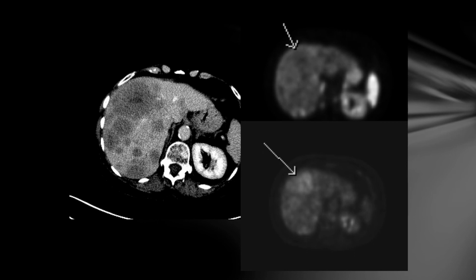So this shows that a cell that takes up a lot of the sugar molecule is either growing quickly, or it's not really expressing those cell surface markers of neuroendocrine tumours anymore. It's a little bit less organised, what we call loss of differentiation.